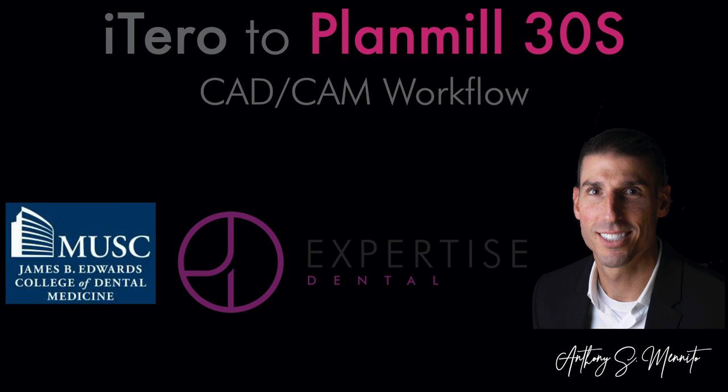It's only a few minutes slower than using an inherent scanner like Planmeca's Emerald S within Romexis itself. So there is a little bit of increased time factor, but it's very slight. And if you already have the iTero scanner and you're looking to add a mill, I would seriously consider this workflow.